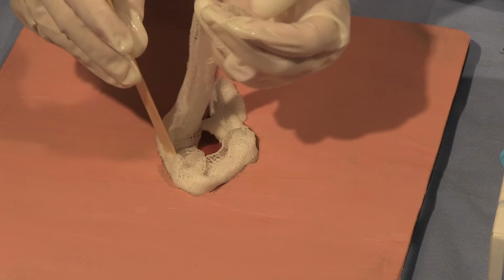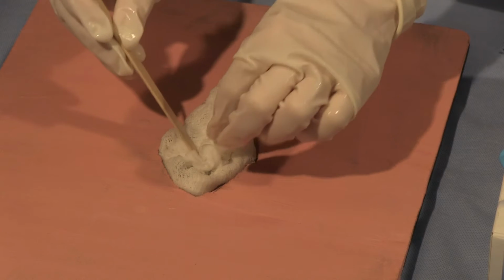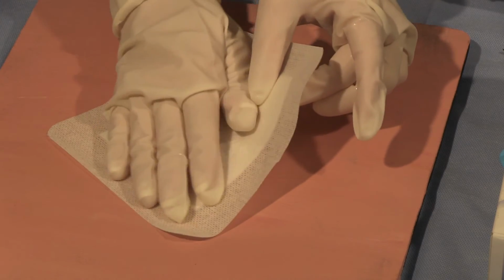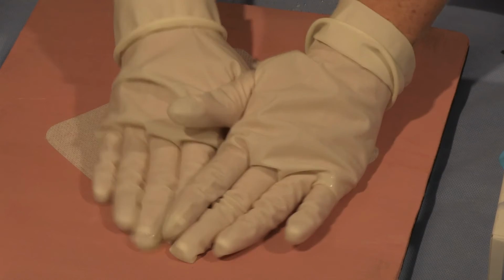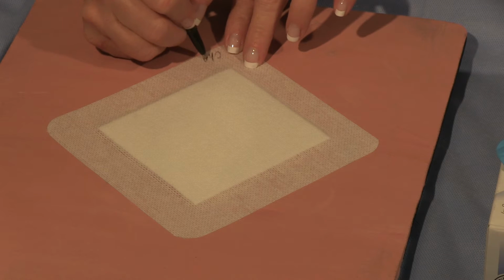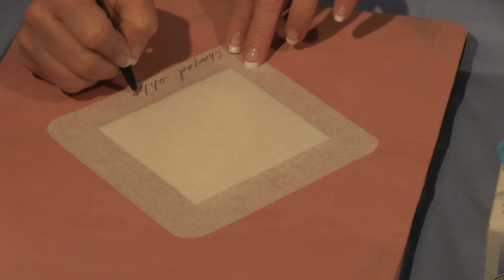Once the bed of the wound is well covered by the wet 4x4 cotton dressing, the sterile dry dressing is retrieved from its sterile package. It is unfolded and placed with the adhesive borders outside of the wound. Once the wound is covered, the medical assistant removes his or her gloves and labels the external surface of the dry dressing with the date, time, and his or her initials. The medical assistant cleans his or her hands and proceeds to chart the dressing change.